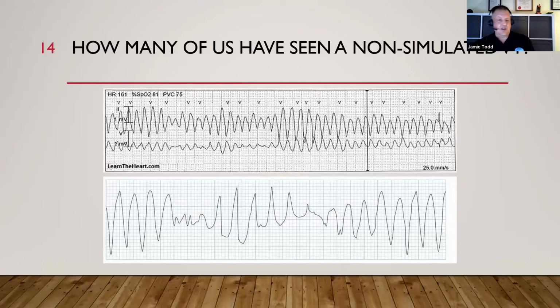And you've got up to 5 seconds paused. So you've got 2 to 2.5 seconds to make a decision and implement that decision. So CPR is recommenced within 5 seconds after you've pressed charge if you're in manual defibrillation mode, or fast enough to get the machine to charge to deliver a shock. So I think that's also very problematic, rhythms that we just don't see that often. And then people are debating whether it's what it is and should they shock it or not, and so on. That probably doesn't help.